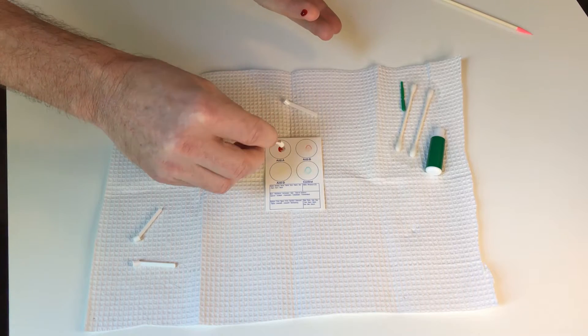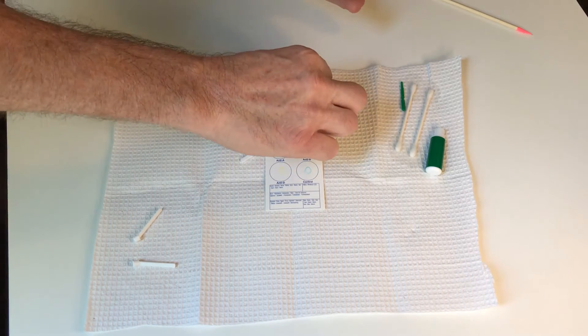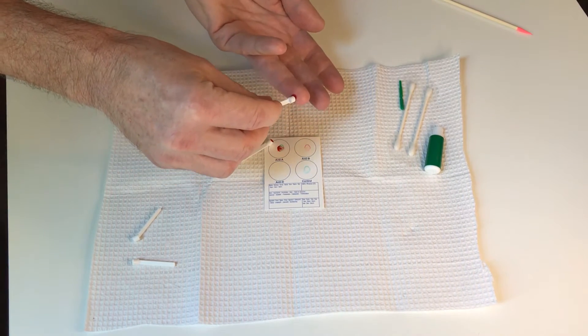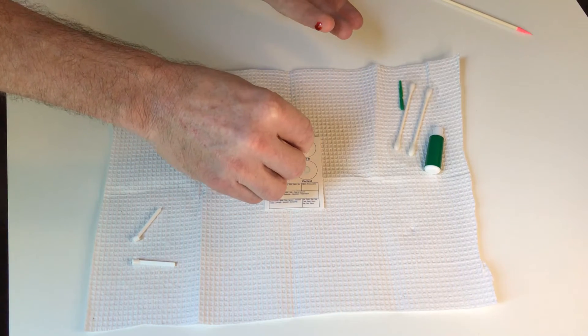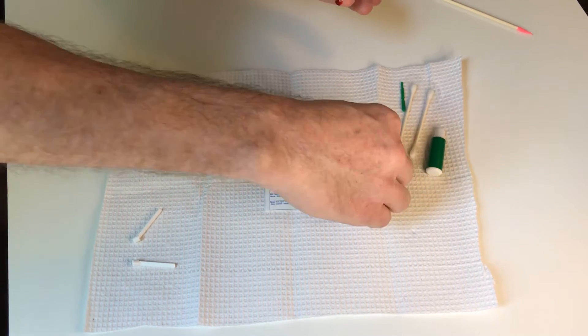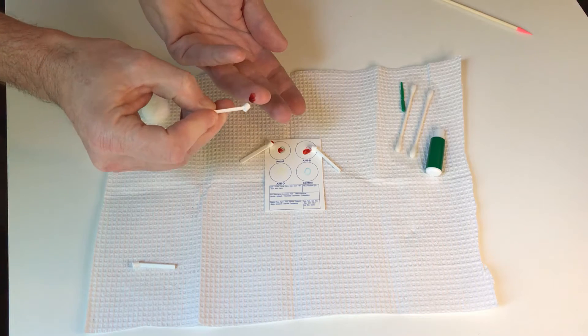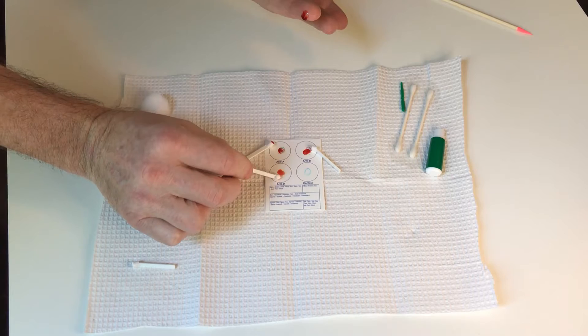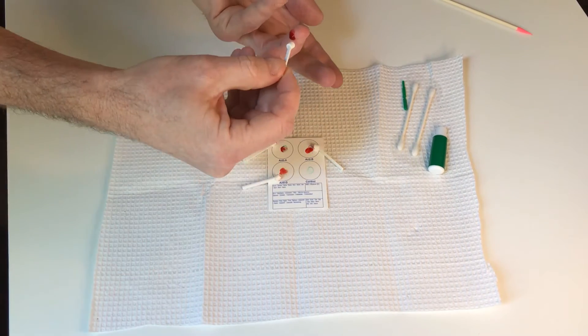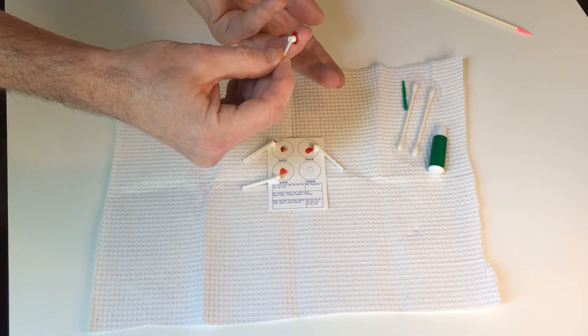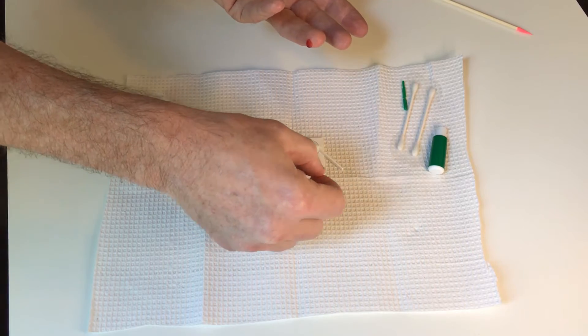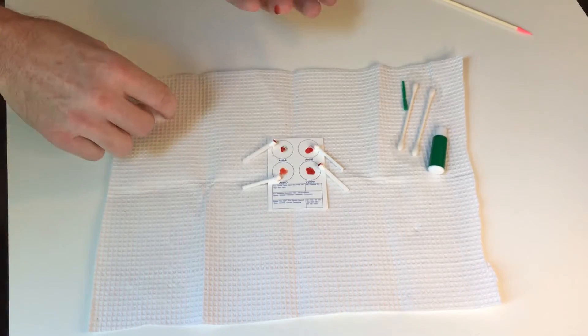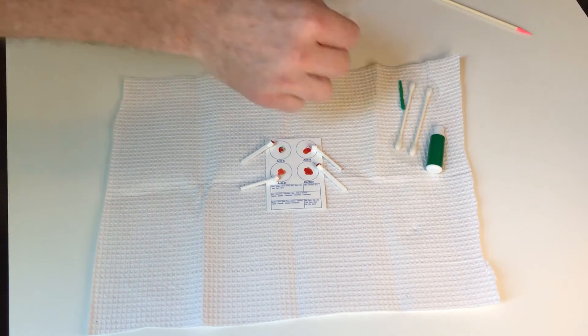I'm going to get one of these little sticks, get some blood on it, put it on there and leave it for a second. Get another stick, put it on there, leave it for a second. Get another stick, put it on there, leave it for a second. And then the control, get it on there and leave it.